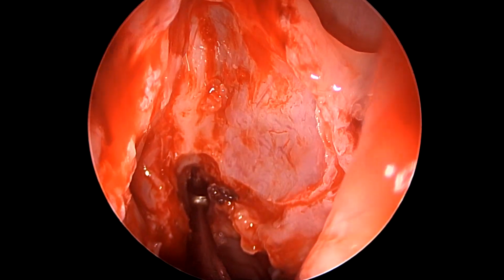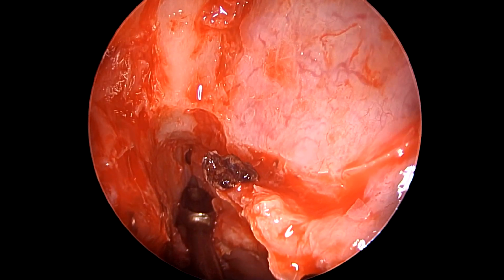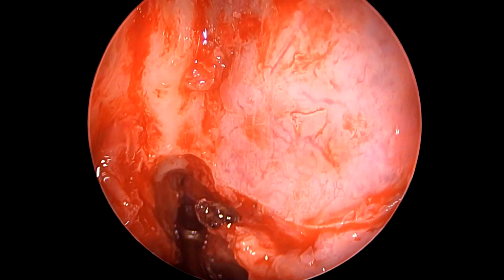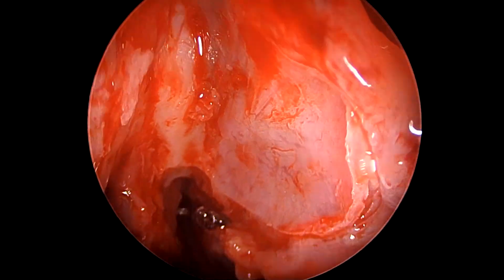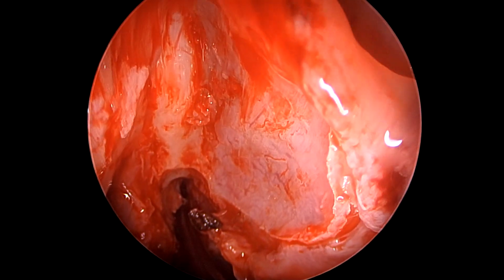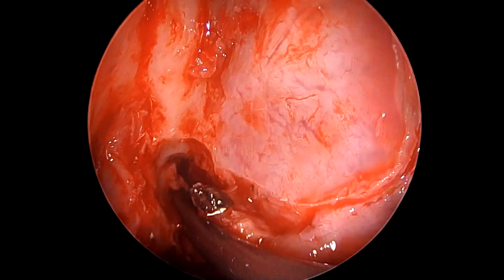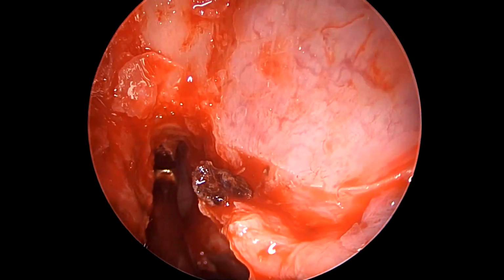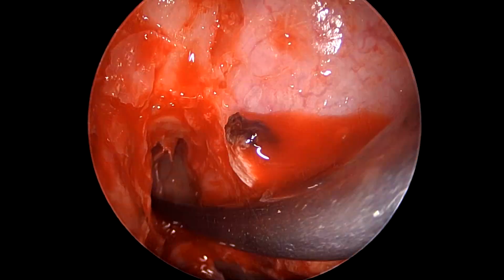Well, as we have punched out a little bit of bone with this punch, now you see we again use our curette to see if we have actually entered the frontal sinus proper. Now, as you see here, this was a large T3 cell occupying more than 50% of the height of the frontal sinus, and now we have actually fractured that cell, like this, with the frontal sinus curette, and now we seem to be gaining access to inside the frontal sinus proper.